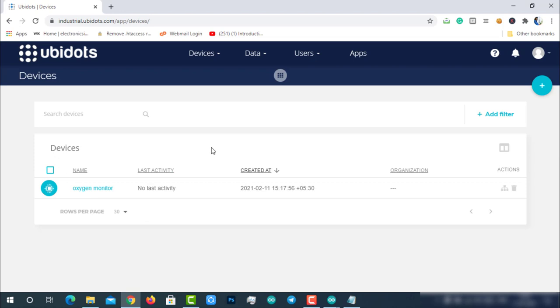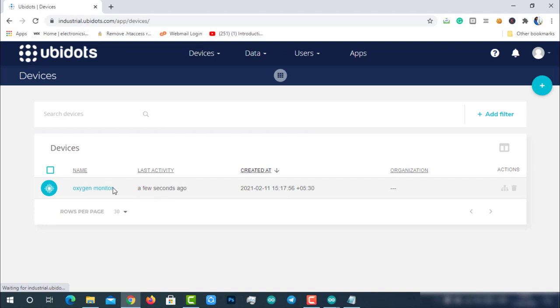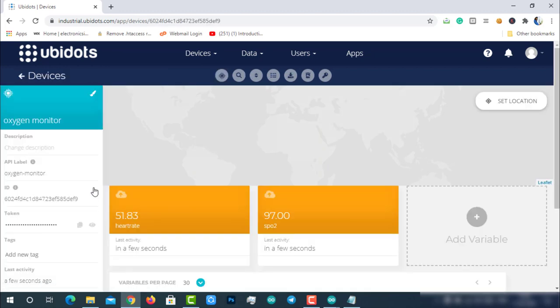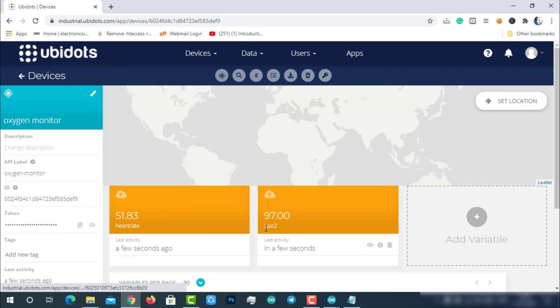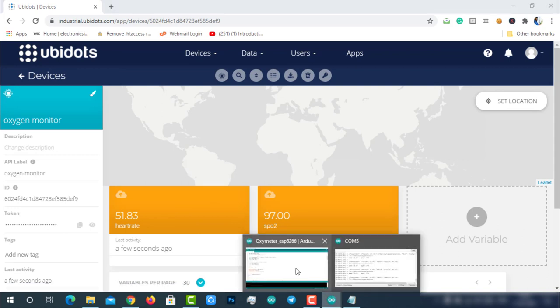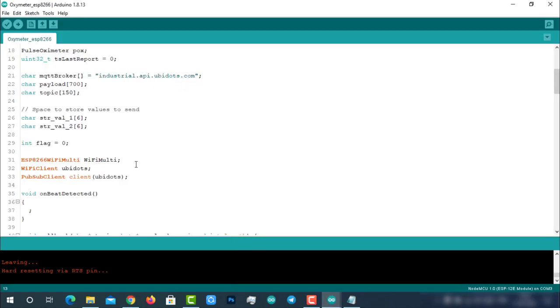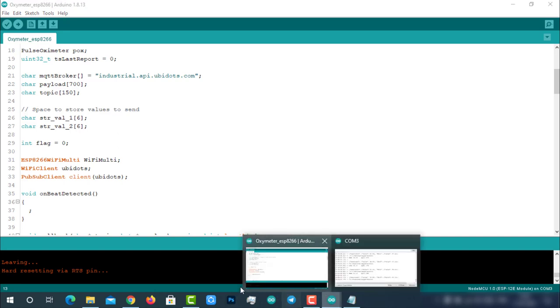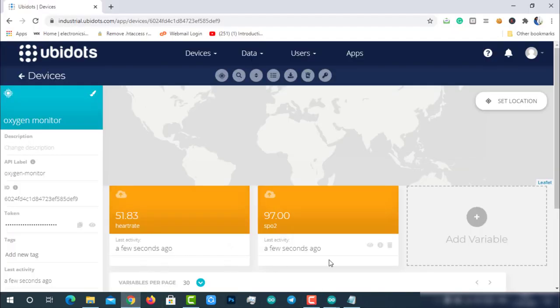Now go to Ubidots and reload it. You can see the last activity in a few seconds, which means our pulse oximeter is communicating with Ubidots. The best part of Ubidots is if it receives data from any module, it will automatically create those variables and start storing data for us. Here you can see the same variables are created automatically.